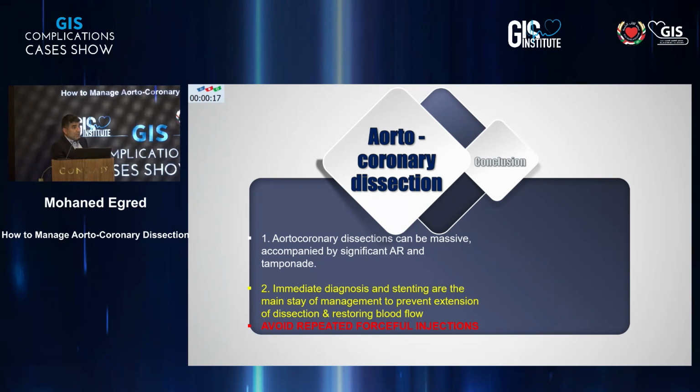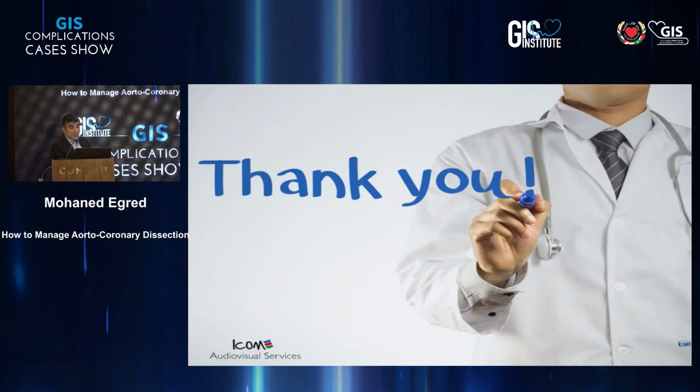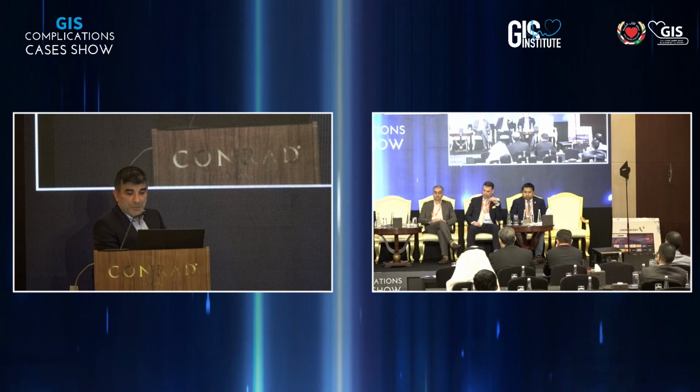And really, this is the main thing. If you remember, just avoid repeated injection. The more you inject, the more you propagate the dissection if you haven't sealed it by a stent. Sometimes you have to use mechanical support devices, and rarely, I don't think I've seen so far, because everything has advanced and our experience has advanced in how we manage these cases. Referral for surgery can still happen, but you'll be able to judge what you need to do on a case-by-case basis.